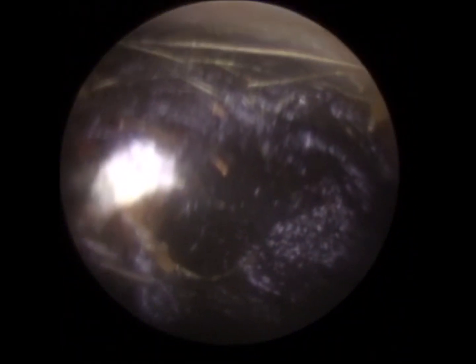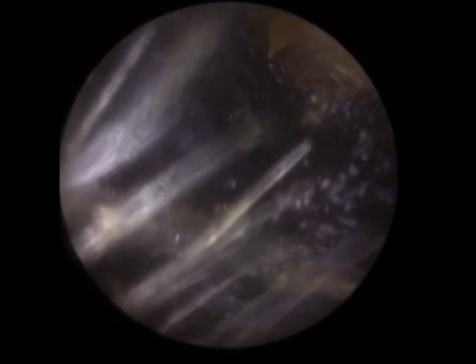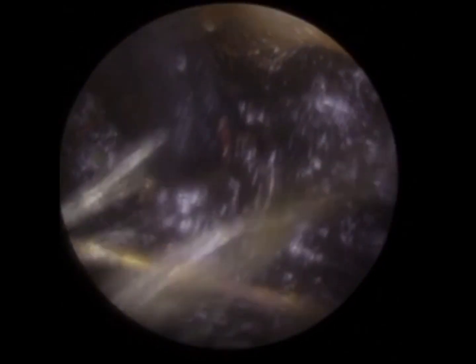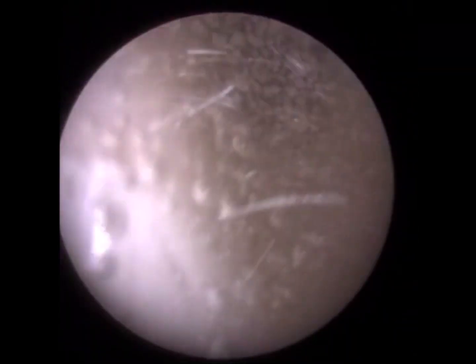But it's almost like a chocolate fondant. You go in, you break into the surface of the earwax into the core, the middle, and it's really soft and gooey. And you can see it's a bit gooey there. You can see the shape of the Jobson horn in the middle of the wax. So Jobson horn helped me initially, but as the procedure went forward, it wasn't as effective, and I had to resort to an ear hook.